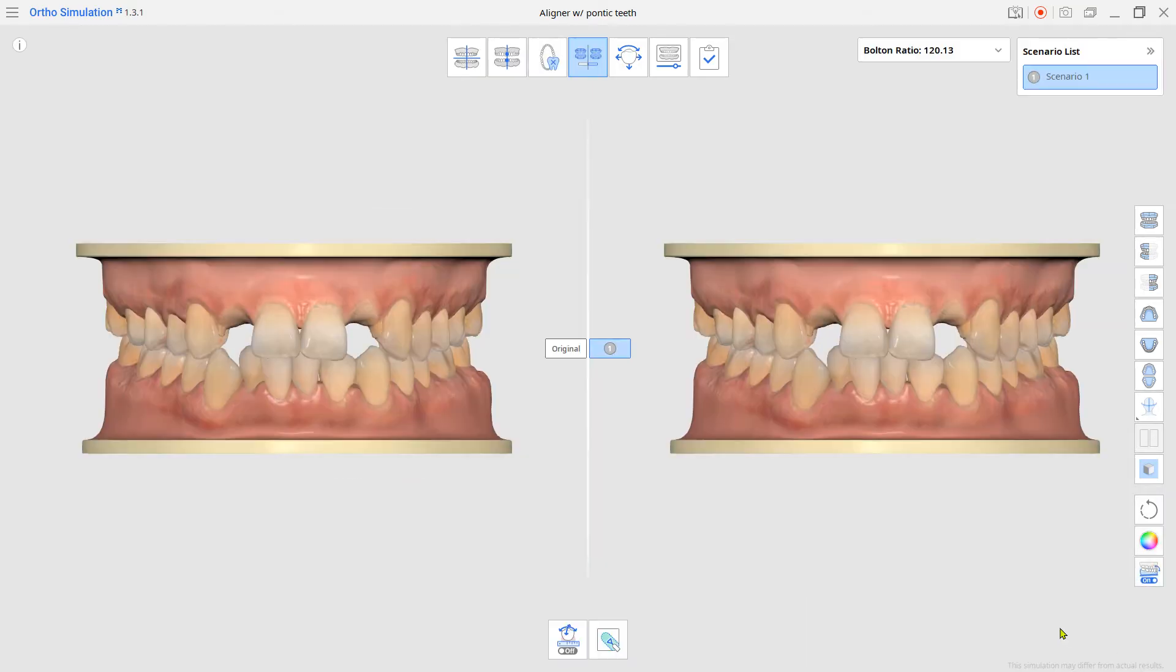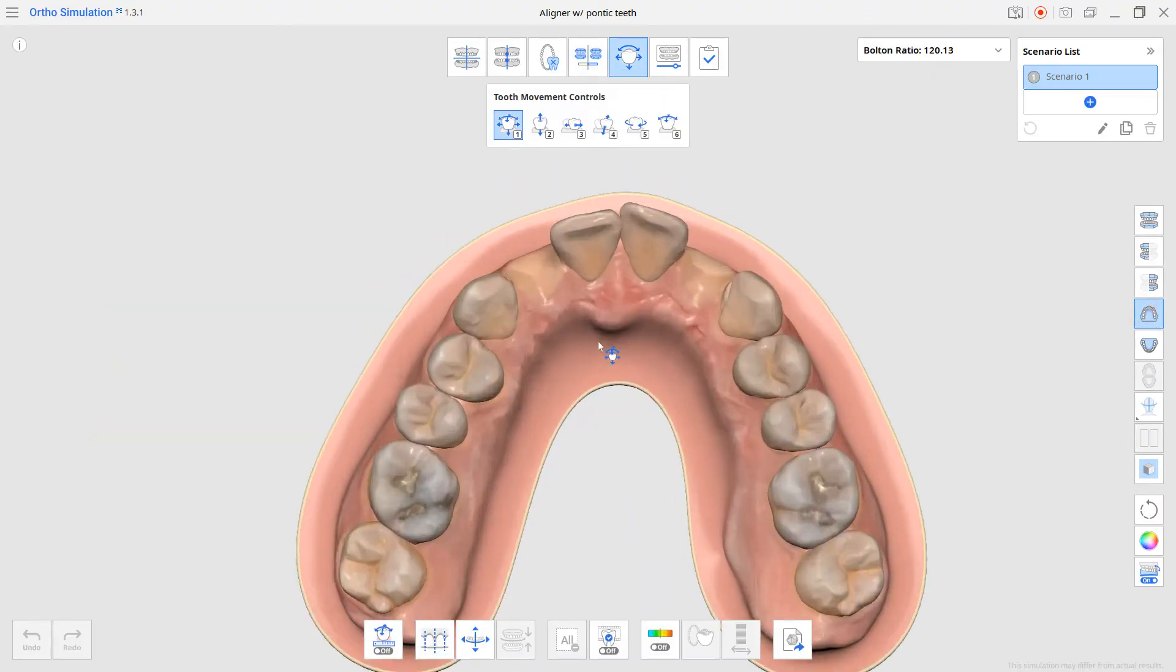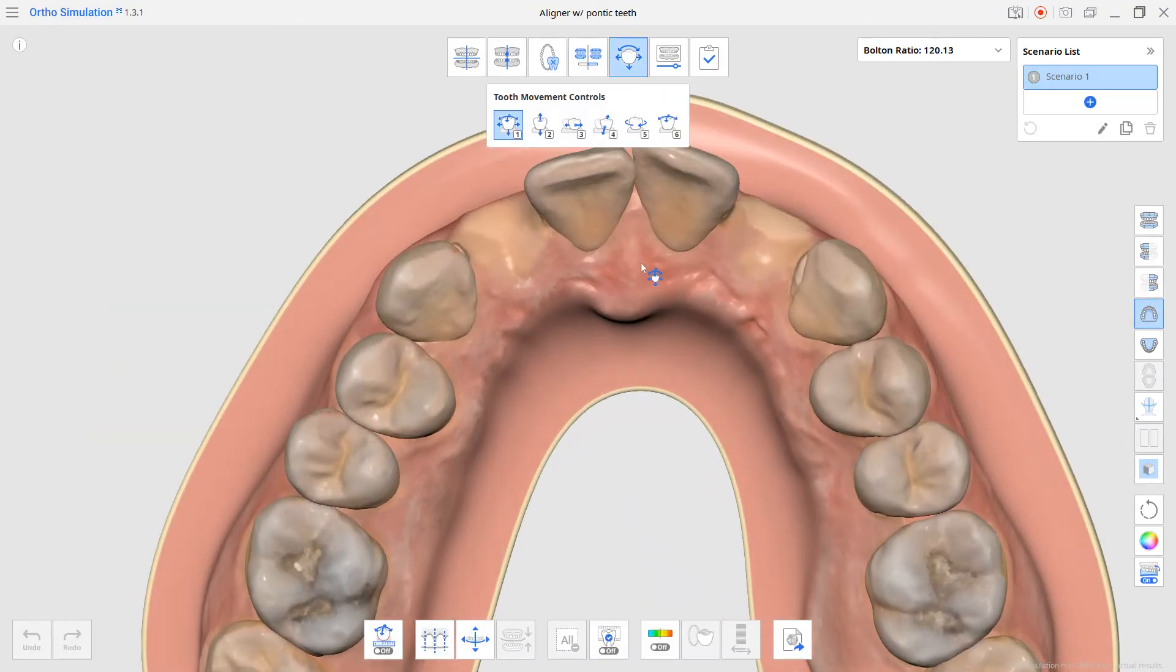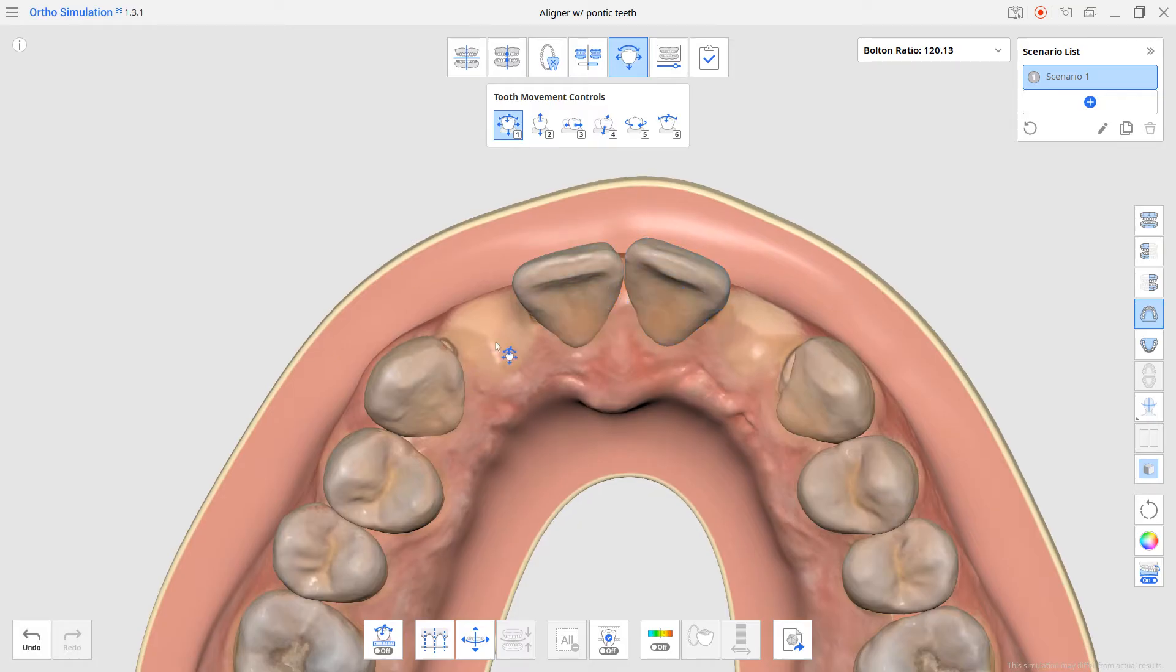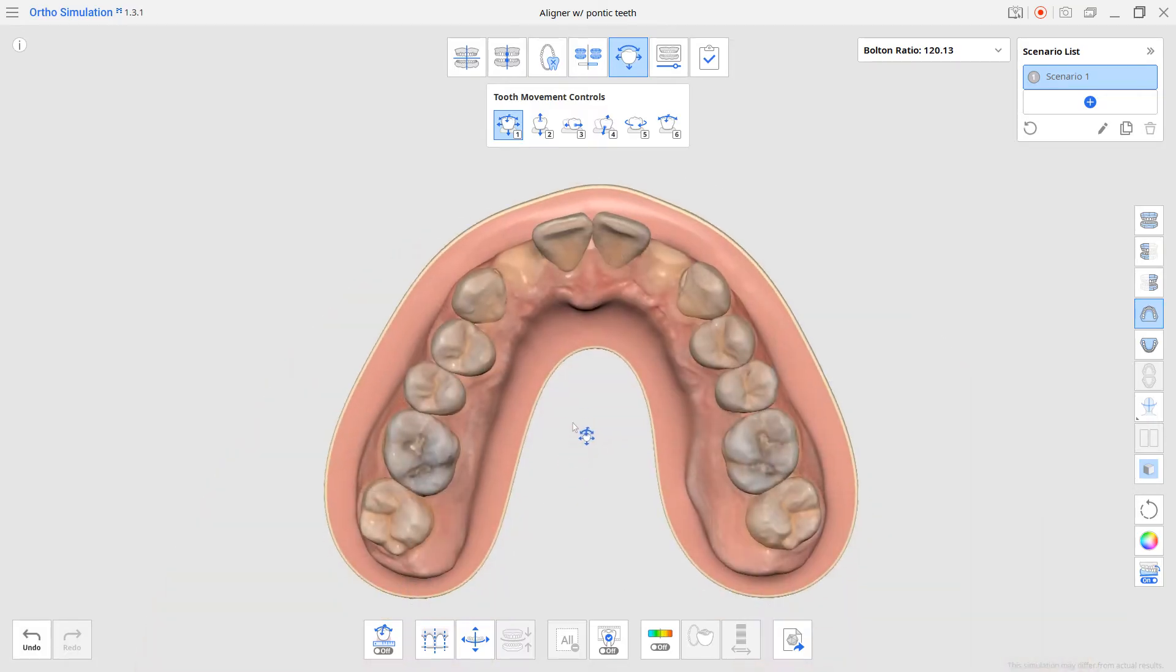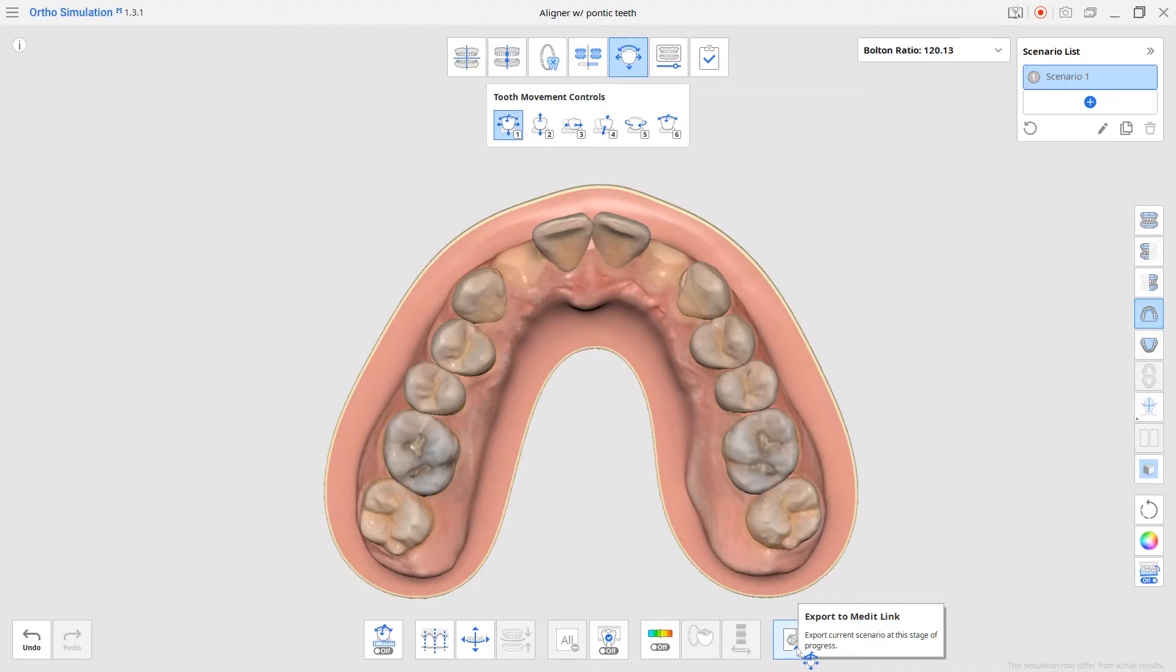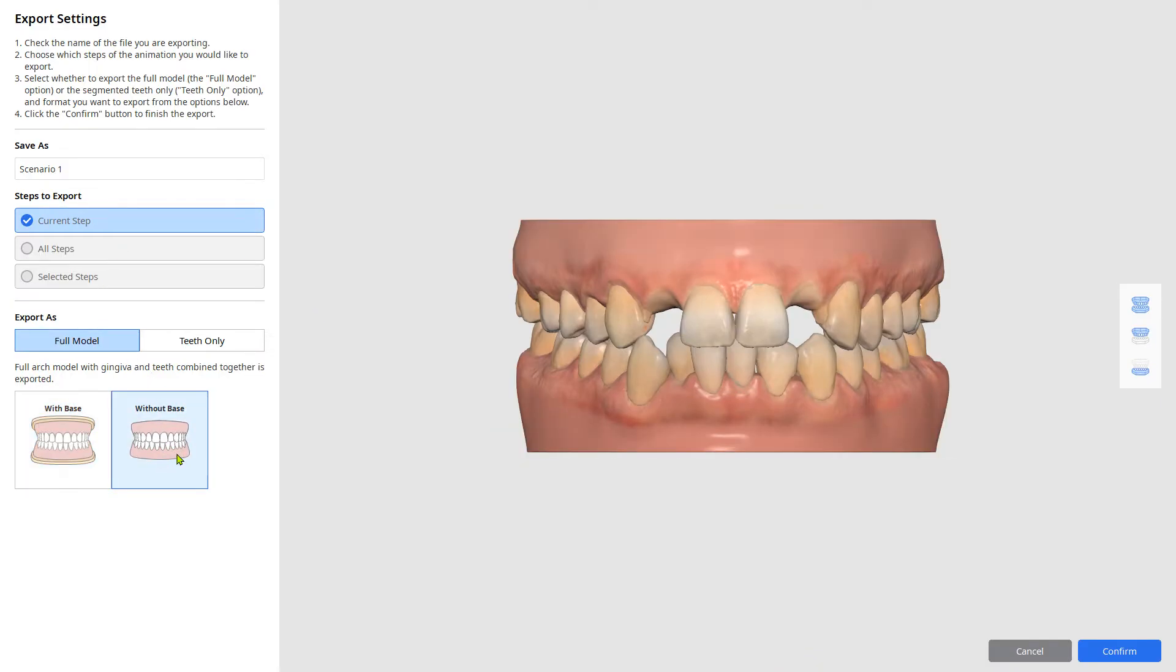Go to advanced adjustments and adjust the teeth position with the tooth movement controls. After setting up the teeth, export the data from the bottom. Choose the current step and export as a full model without a base.